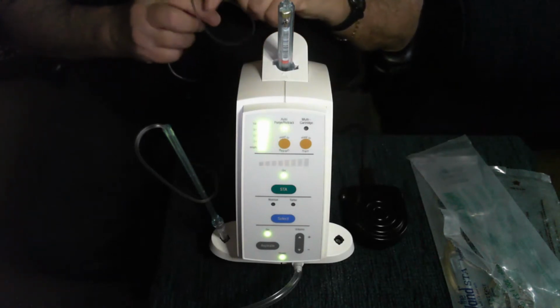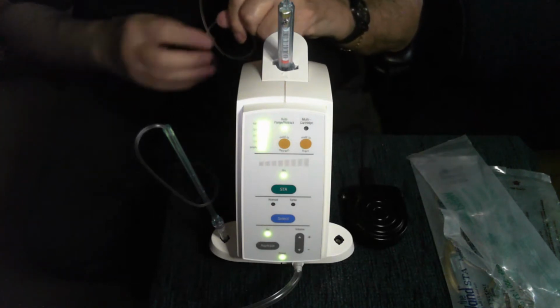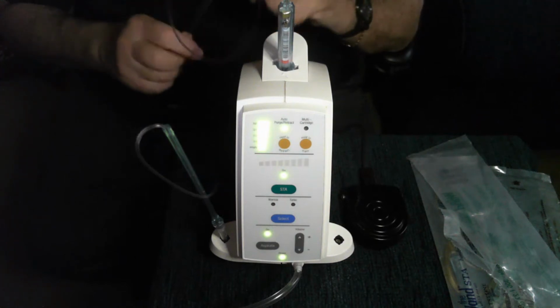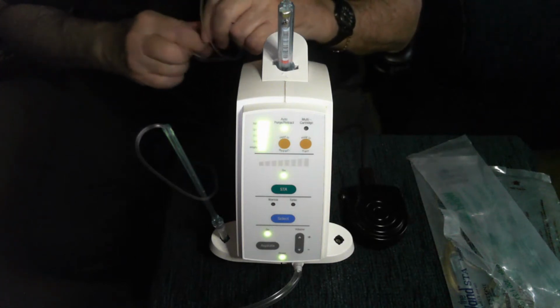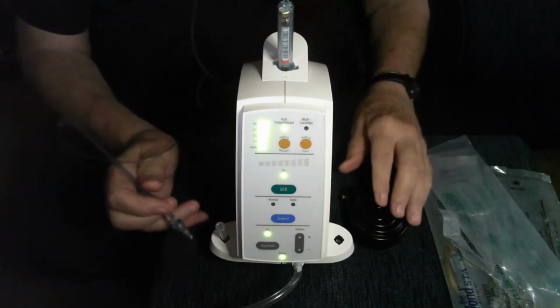You don't have to actually look at that. You're going to be able to hear a sound. So when you hear a sound like a gong, that tells you that you've delivered 1/4 of the cartridge. When you hear gong gong, that means you've delivered half of the cartridge. So now we're ready to start to deliver the anesthetic.